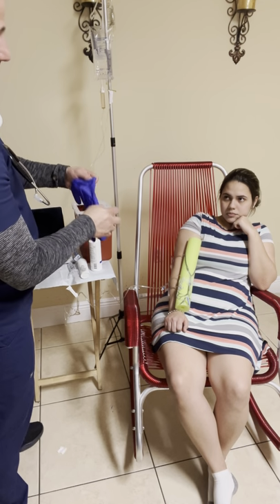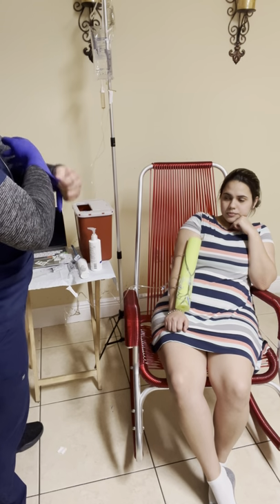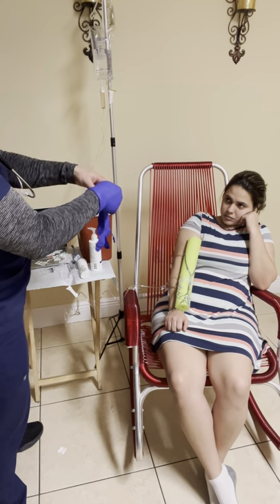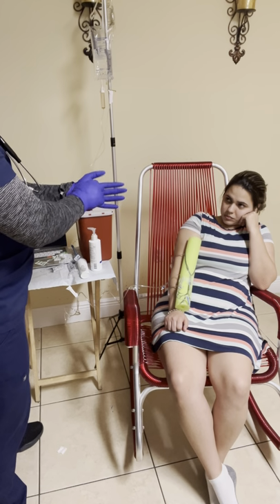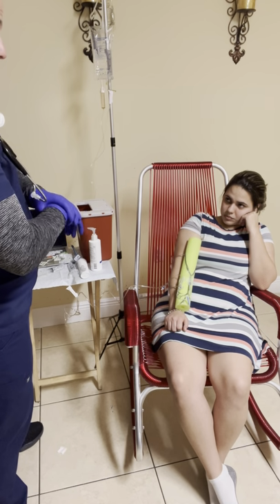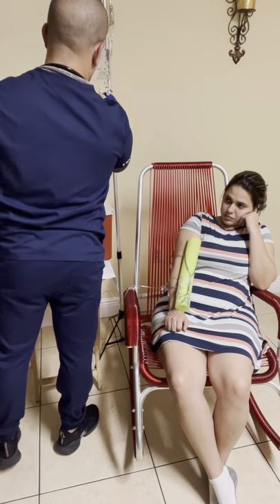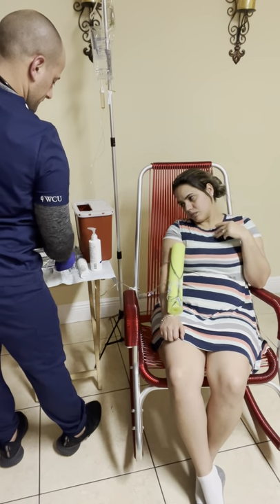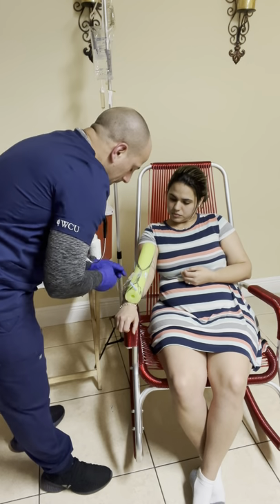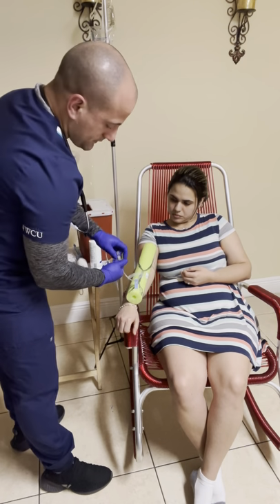Hi Rosalia, how do you feel today? Fine, thank you. Awesome, nice to hear that. I know that you will be discharged today from the hospital, so I have to take off your catheter, okay? I'm going to close all the clamps, all the rollers, okay? I'm going to disconnect the IV line.